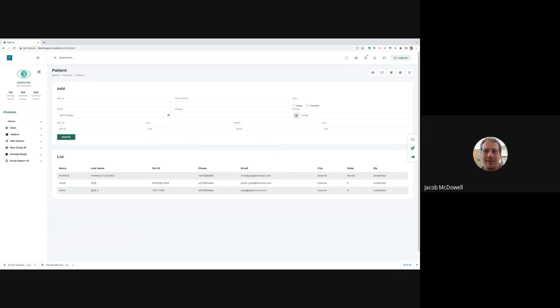I think the way this is going to connect the most with radiology is that there has to be something really distinct in the image itself. The first impression is going to be looking at the image, right? They're going to look at a radiological image and at this physiological image, and they're going to get a fast conclusion that yes, this works. I don't think reading the data itself is going to mean too much to them.